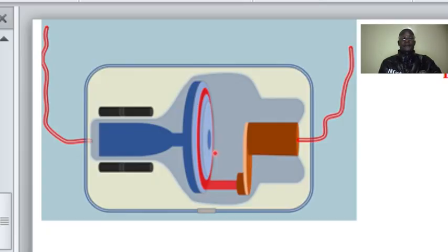Now, anode, this is our anode. Now this is what our anode looks like. We have produced the electrons within the cathode. We have accelerated them now to the anode. Now, upon reaching the anode, they interact with the anode. After interacting with the anode, then we expect the X-ray now to be produced.